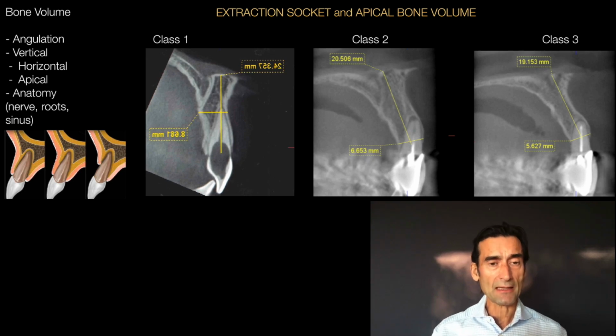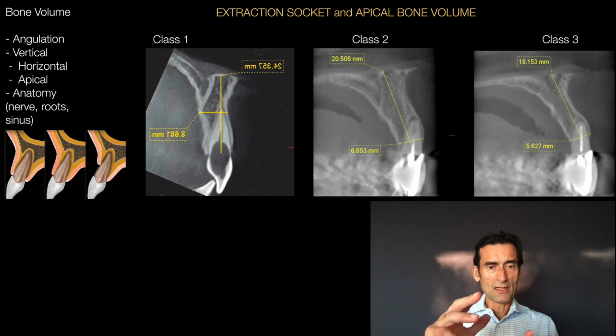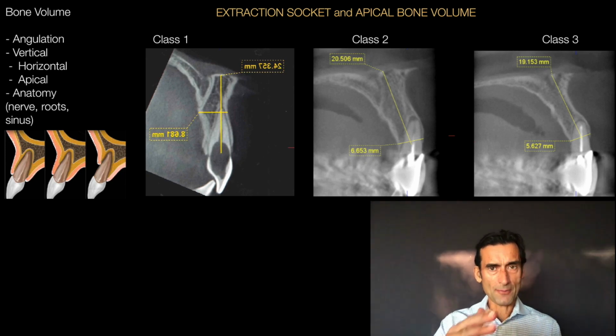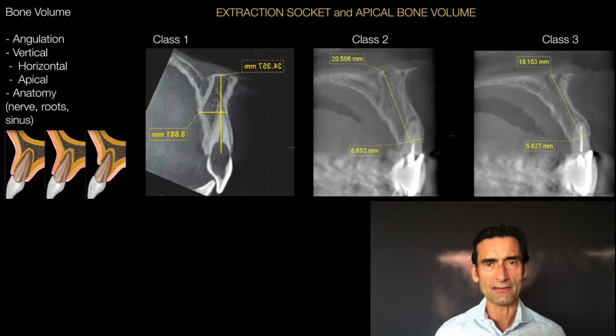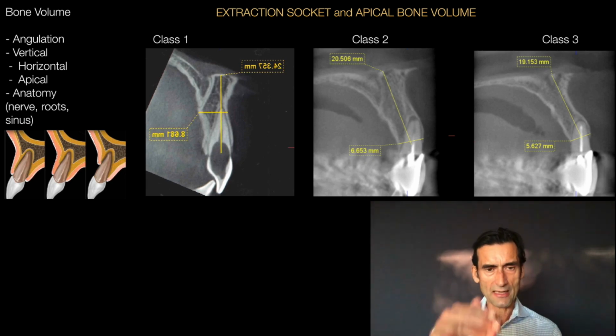Now, there's another area of implants that you have to think about, which is how does the bone relate around the root in the future implant placement? Because roots can be at an angle in the bone. Implants usually go straight up and down or maybe with a little angulation, but really in an aesthetic case it's not that ideal because angulated abutments always give you a little bit of compromise in that kind of steep angle.